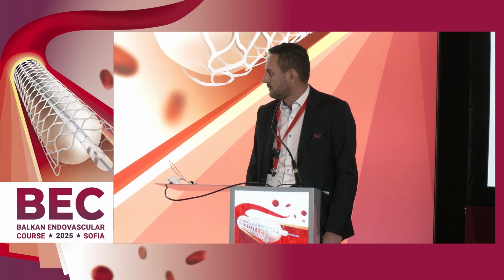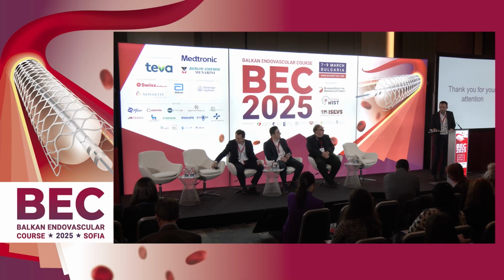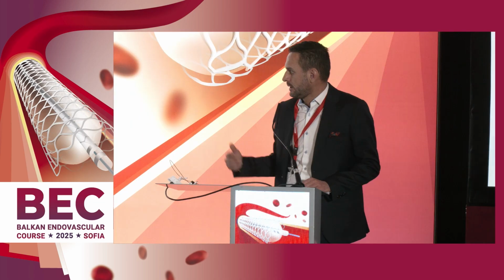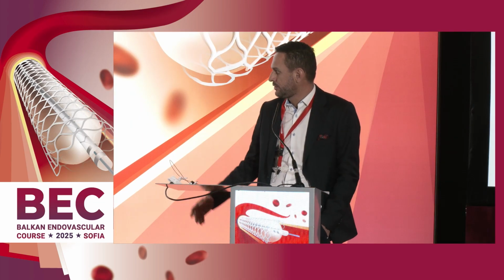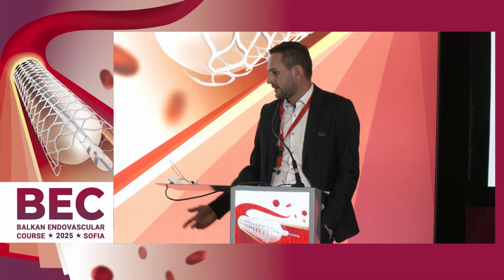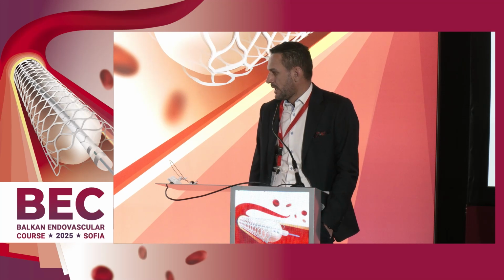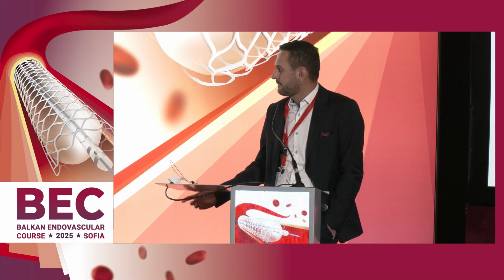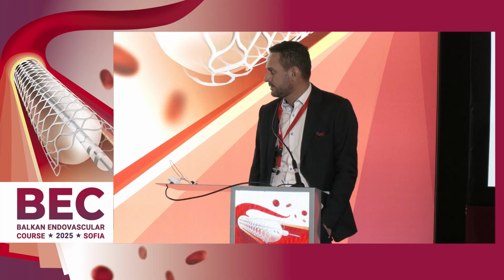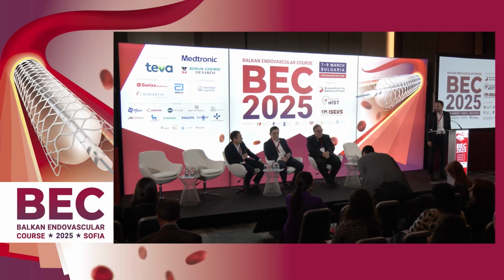How do you select patients for primary tibial access? The patient with previous intervention, we have data from the angio. We know we can proceed with radial access only for the angio, to use the tibial approach, and after that, when we have the data for the patient and for the lesion, we take the tibial approach as the primary approach. And what is the usual size of sheath you use for primary tibial?